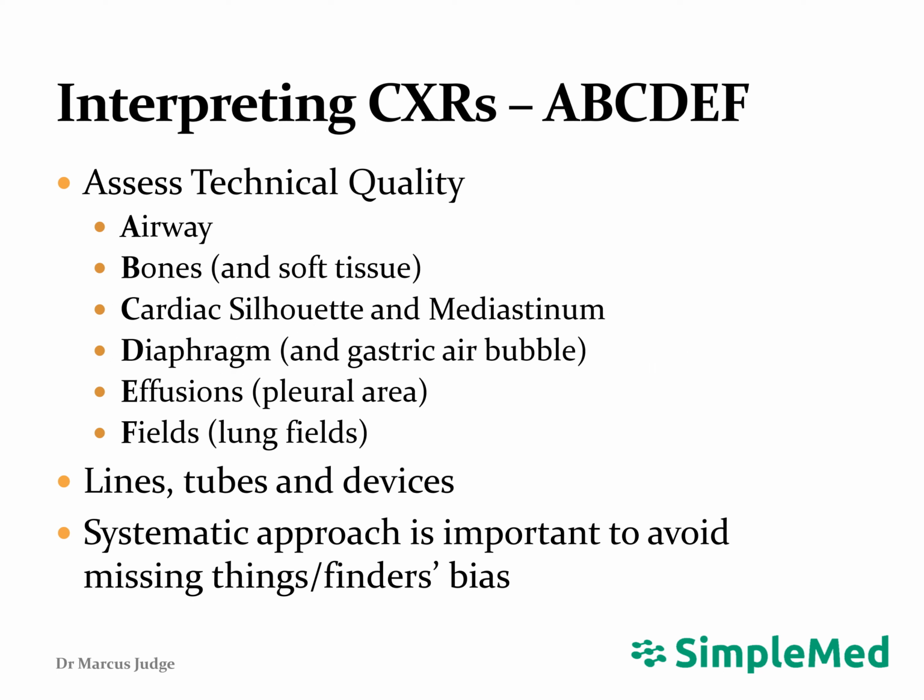Here is an overview of the systematic approach that can be used for optimal chest X-ray interpretation.